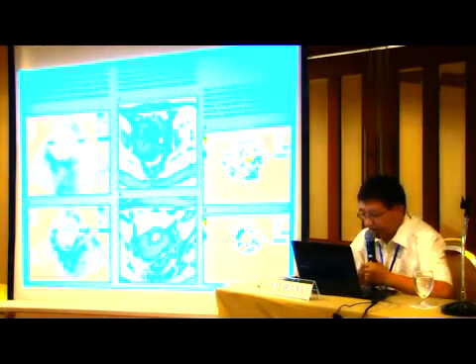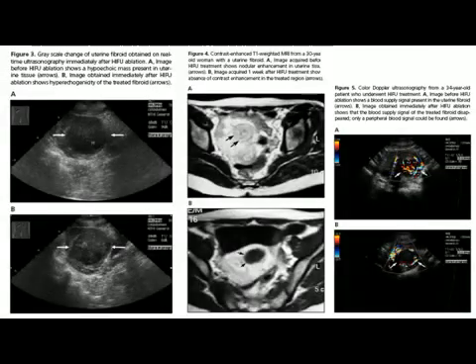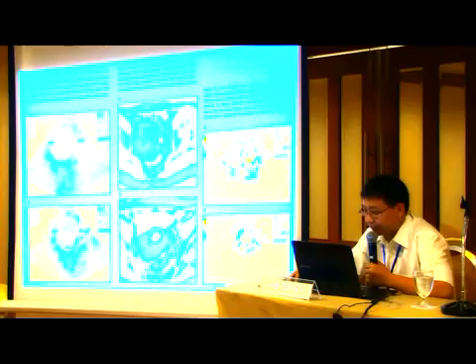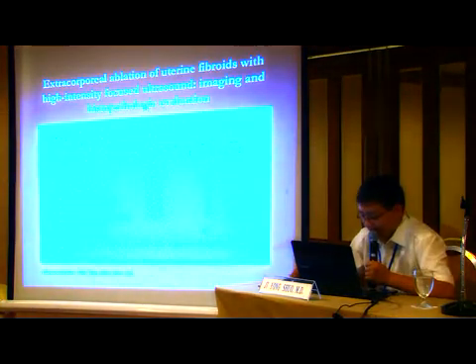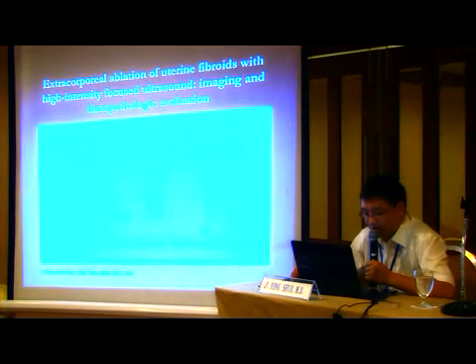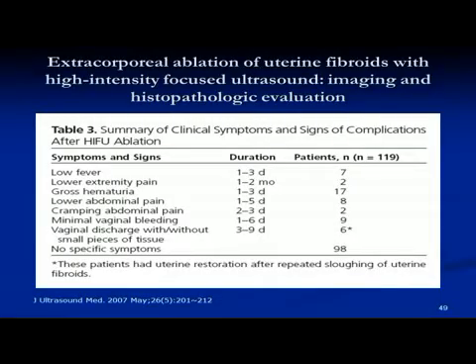B-mode ultrasound, MRI and Doppler after the treatment of HIFU are basically accordant. We can also notice the changes after the treatment of HIFU. These are the common complications, which are all light with low incidence. More and more devices are authorized gradually, and the clinical application of HIFU has further broken through in China.